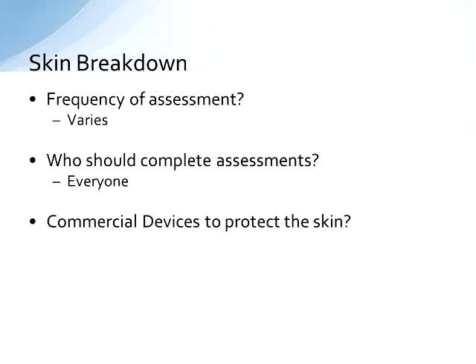Should you use commercial devices to protect the skin? I think this depends on who you ask. The Wound Ostomy Incontinence Nursing Society published a position statement in 2010 on prevention and management of pressure ulcers in general, and they just sort of generically said that transparent films may be used on the face of individuals on NIV. But what device should you use? Should you use it on every patient? Some places use Duoderm, other places use Mepilex because it's a little bit breathable. It doesn't change the fact that the mask is going to put pressure on the bridge of the nose. It might just provide an extra layer of protection from maybe friction injury.